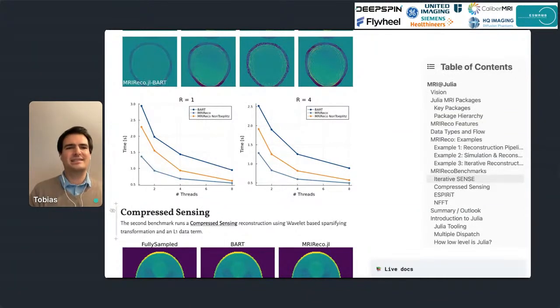So nowadays, with a lot of these optimizations that we put into it, you can see on the x-axis the number of threads that we put in. We have in blue 2 different possibilities. There is either the possibility of using something called the Toeplitz optimization, or there's a non-Toeplitz variant where you use the gridding operators directly.